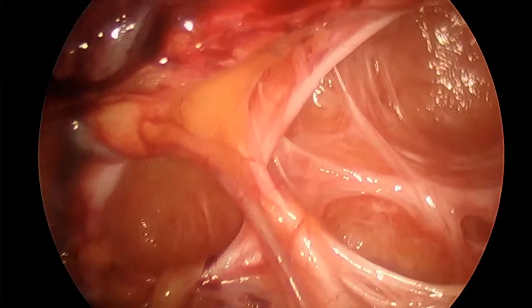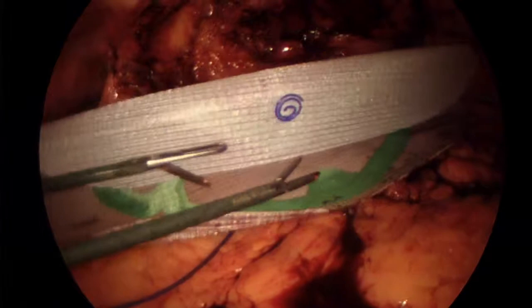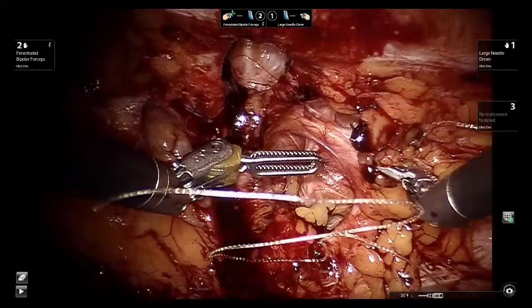We're looking into the hernia sac. At this point, we introduce the mesh, which is the Echo mesh. Utilizing the robotic approach with two instruments, we proceed to start closing the defect from the inside utilizing a barbed suture.